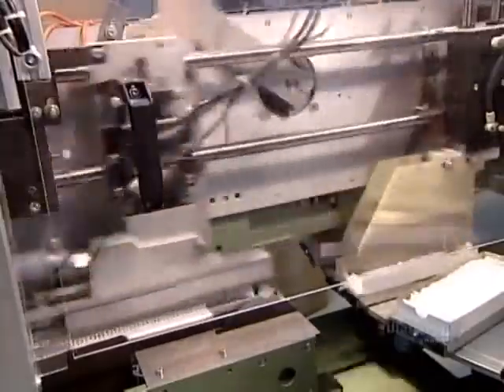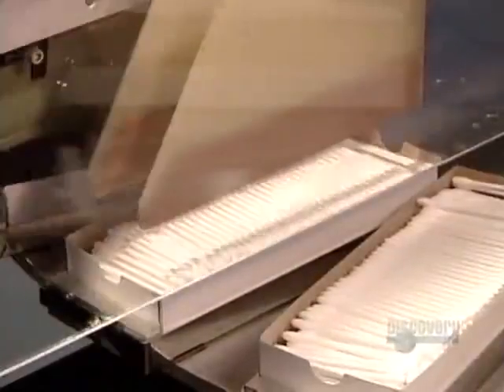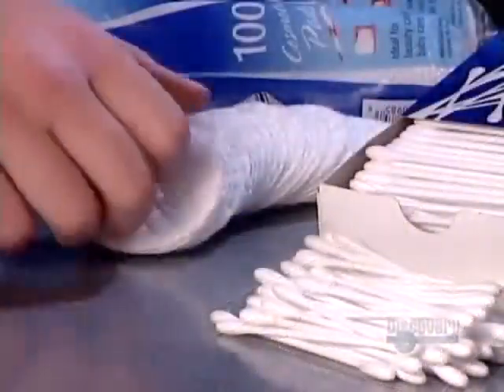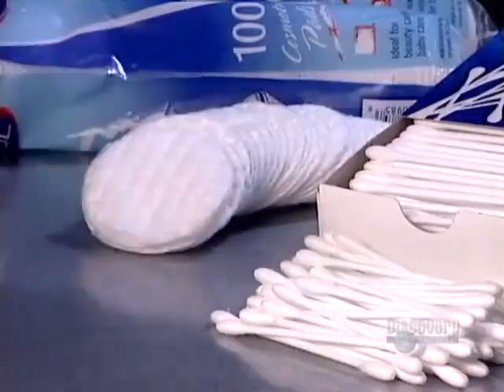Finally, a robotic arm grabs the exact number of swabs per box, again determined by the customer's specs, and packages them. The company's lab does spot checks on its swabs to ensure that the antibacterial solution is working and that the products are germ-free.